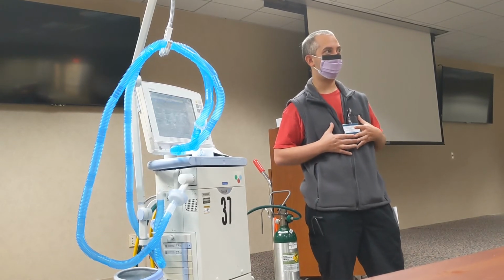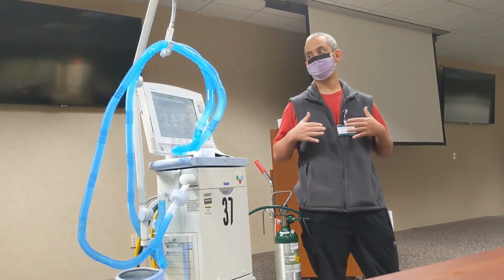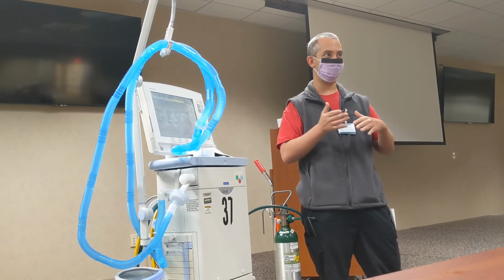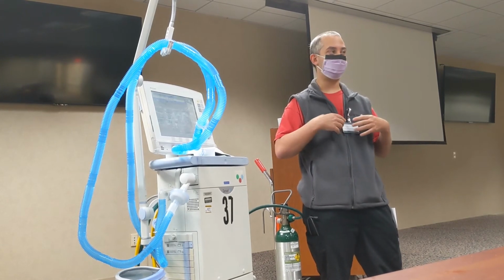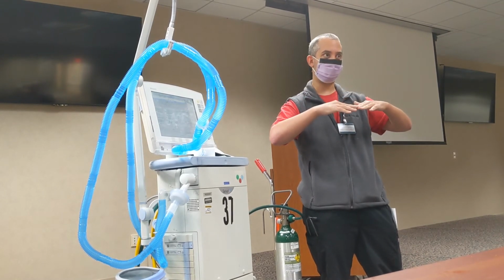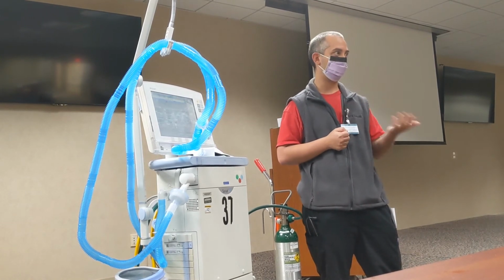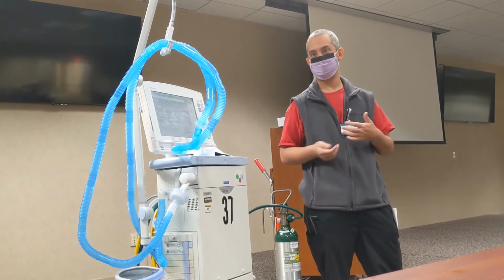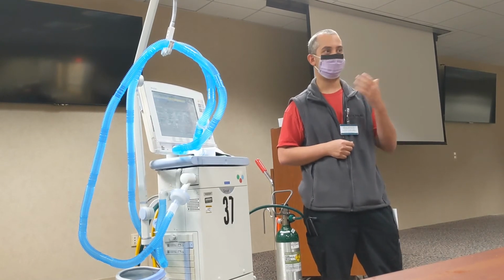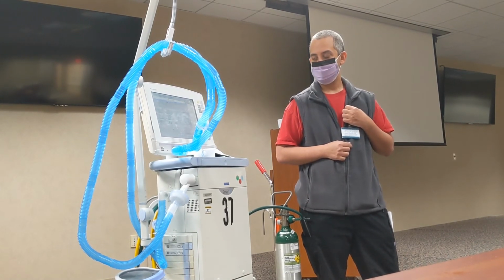When they are doing all of their spontaneous breaths on their own, the transition from there would be from APRV to pressure support CPAP, because now they are doing the ventilation on their own, and you just start slowly coming down on their CPAP more and more, or their pressure support, and eventually it gets to an extubatable point when you get down to 8 or 5 of PEEP at that point, and they're taking adequate volumes on their own.